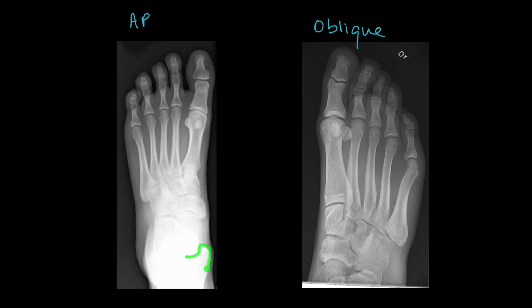You can also see, although the image quality isn't as good here, the tibia and the fibula come into view. And again, we will do the same on this, tracing over our phalanges over here, our metatarsals over here, the cuboid, navicular, lateral, intermediate, medial cuneiforms, our talus, and our calcaneus just coming into view.